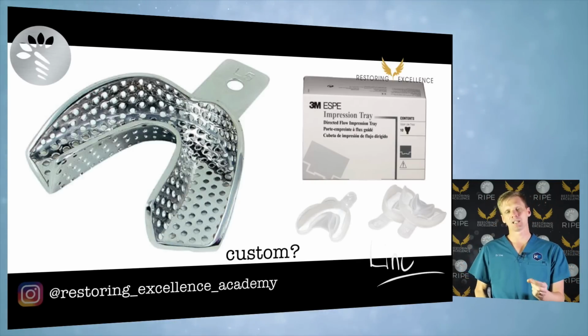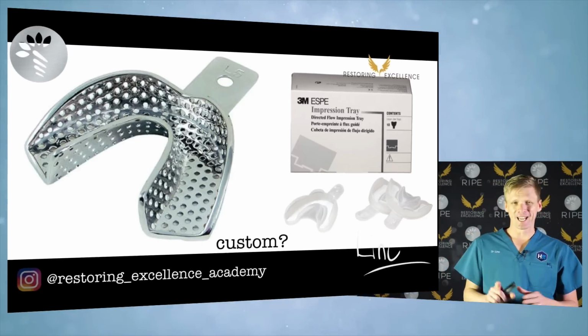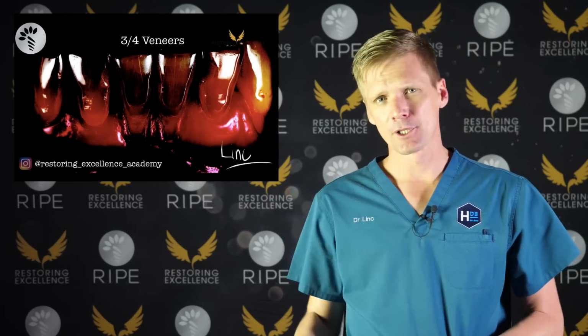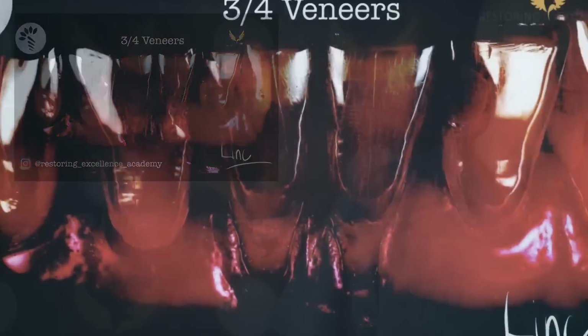You definitely can't use putty in your standard flimsy disposable tray. Now I'll go through some cases to demonstrate some of these things. I won't go through every type of case, but I'll go through some. So we'll go through 3/4 veneers.